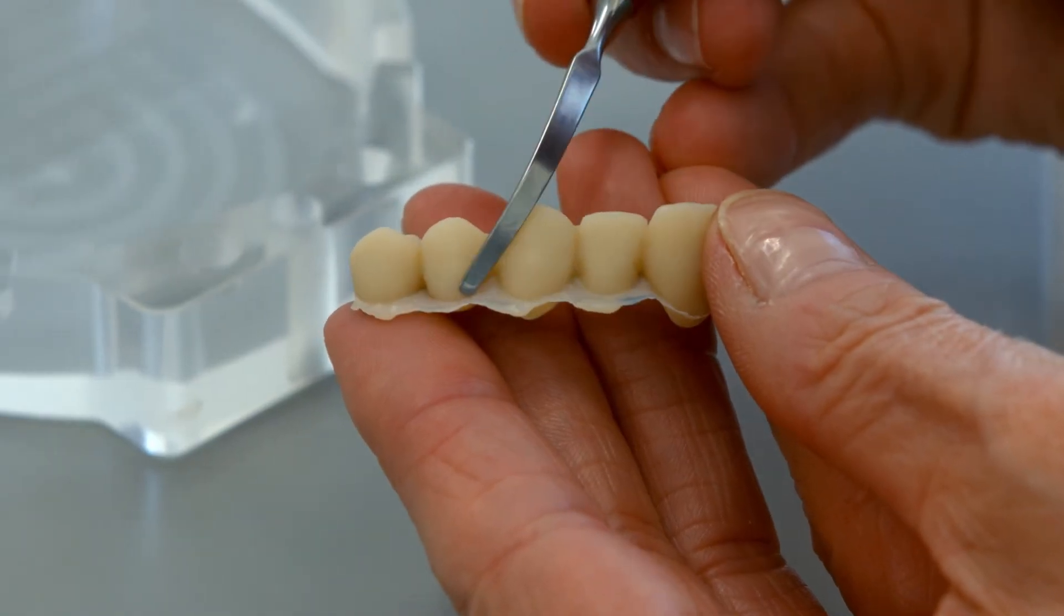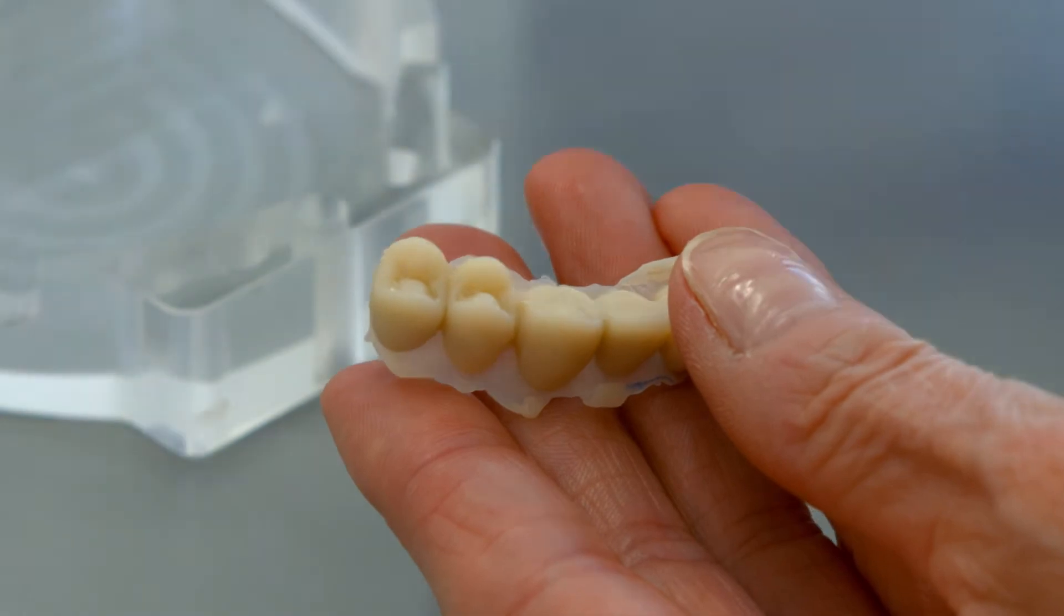Light cure the bridge again after you have removed it from the flask. This is essential to ensuring complete polymerization.